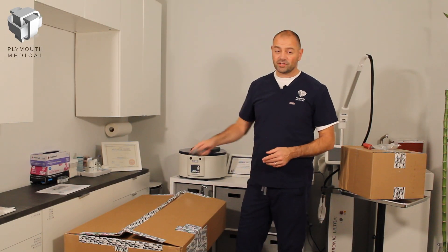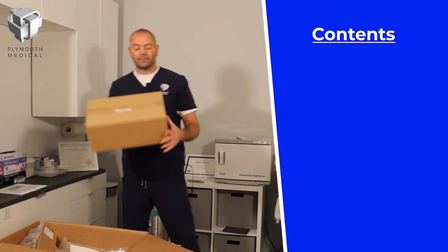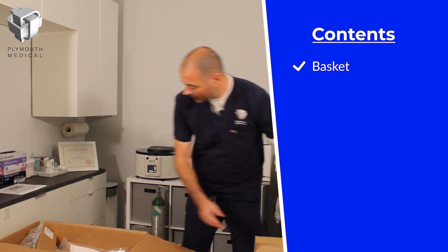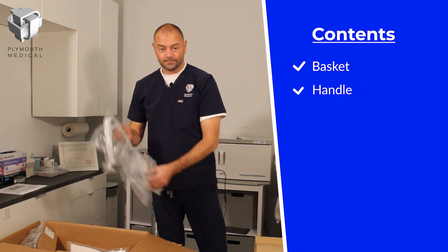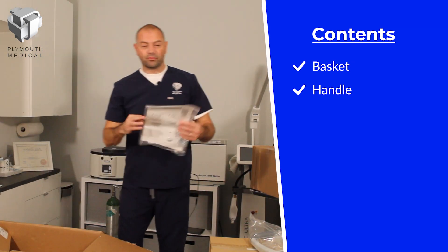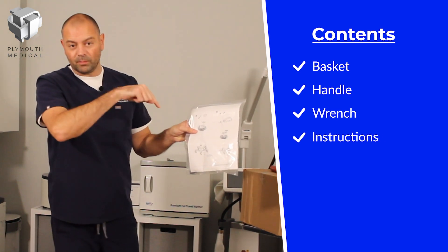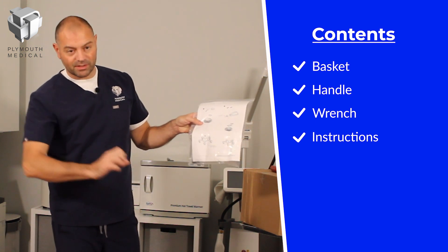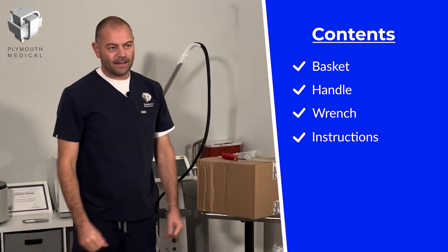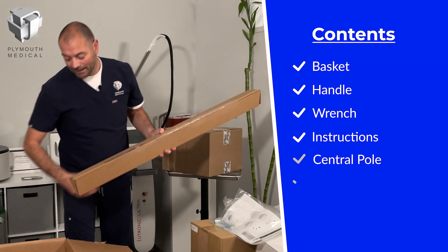Next we turn our attention to the largest box, which contains most of the base components. We have the basket, which attaches to the central pole, and the handle, which allows us to move the machine around. Also in this box is the wrench — quite important — along with the instructions showing the step-by-step assembly order. The final two components are the central pole and the base.